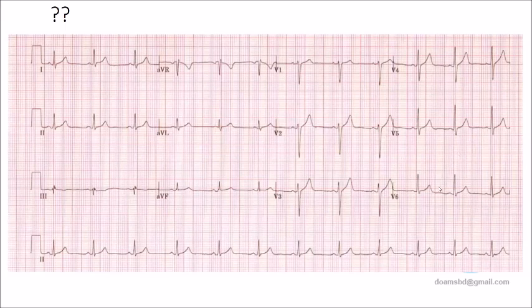So segment, other, everything. If any gross finding, doctor, you can tell. Don't be very minute, look critically. Anyone, please, now. Dr. Femina: Normal ECG. What will be the rate, doctor?